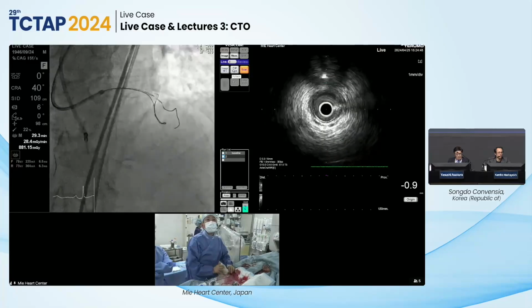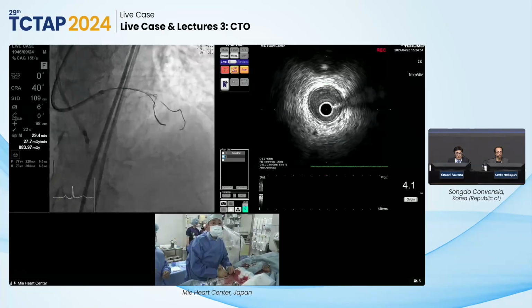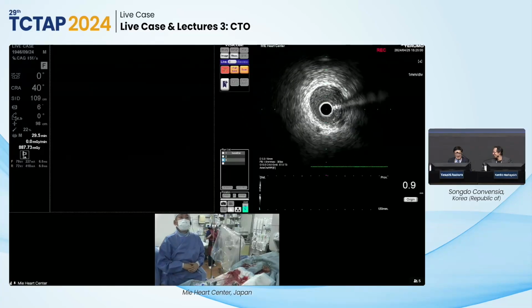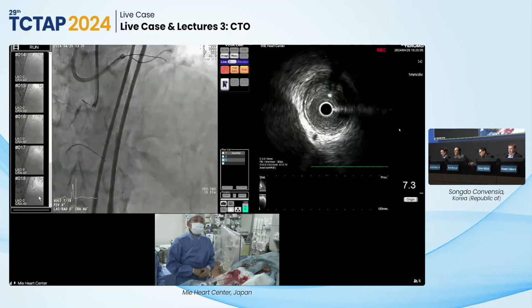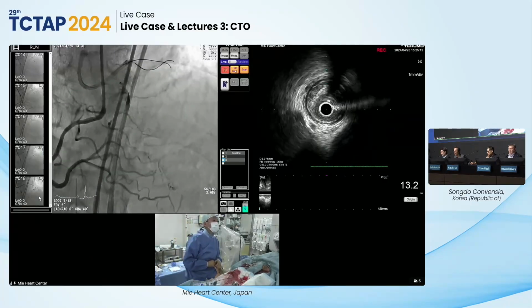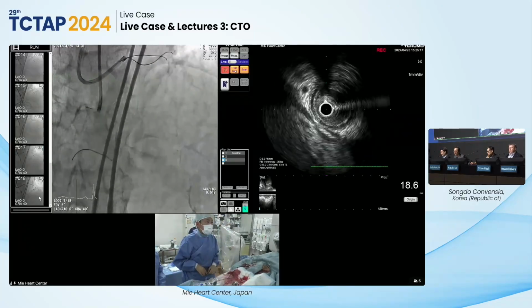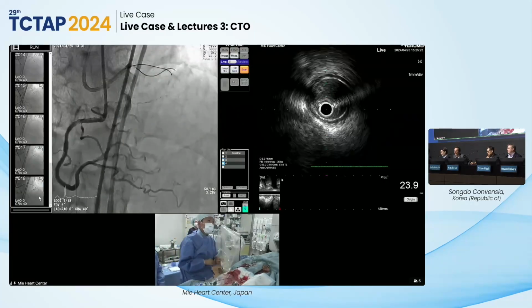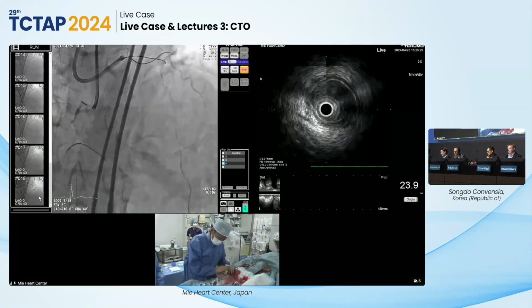Oh, it looks good. He's checking on the IVUS and seems to be. Maybe you want to comment yourself. Are you okay with the puncture or not? The puncture itself, there's some stump there, so at least my wire direction is toward the LAD. But as Kambis said, the LAD itself is very bent around there. My wire goes very easily to the diagonal side, so even though it's the direction, changing the direction is not so easy.